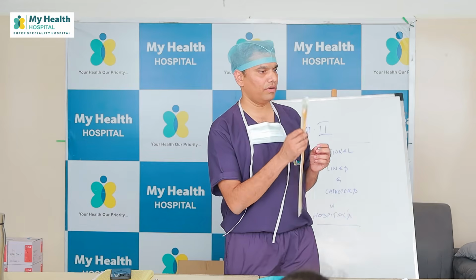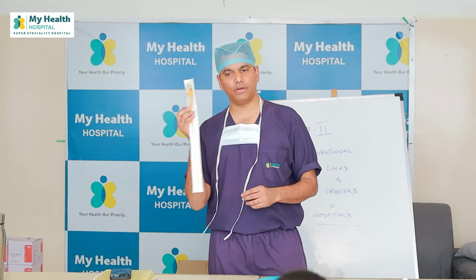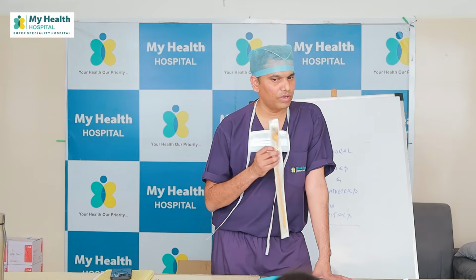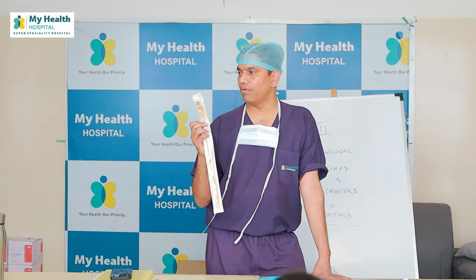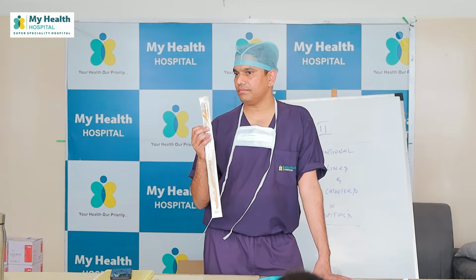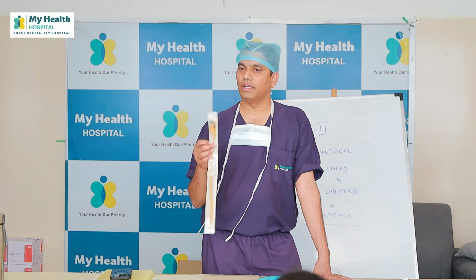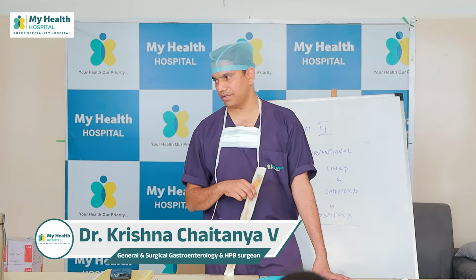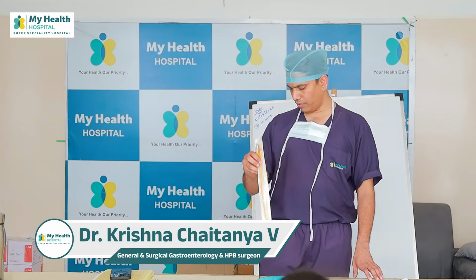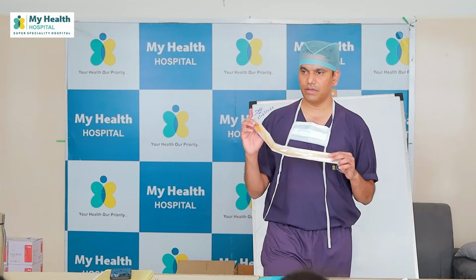What is the difference between Foley's and the three-way drainage catheter? Why does it have 3? It has to go through continuous irrigation. One is irrigation, one is drainage, one is the bulb to fix it in place. Okay, that is the major difference. And this also has the same sizes as in Ryle's tube.